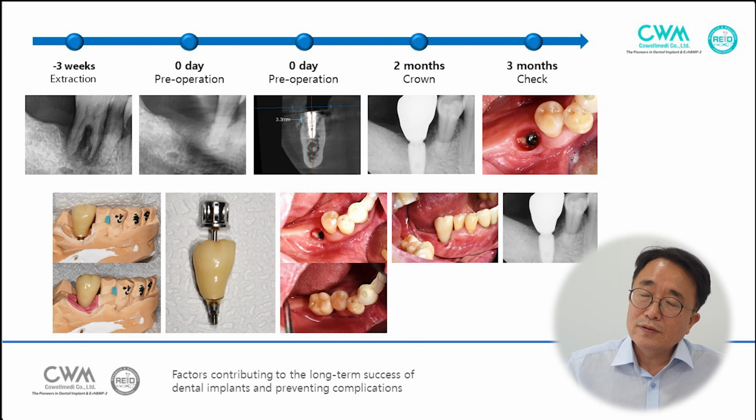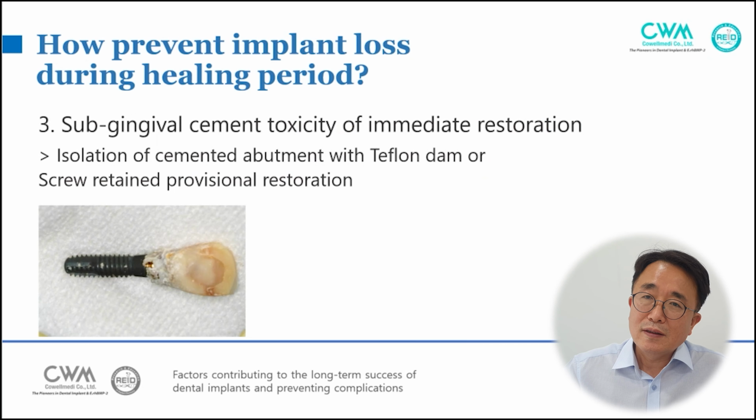So we have to keep this flap closed during the healing period, even if you use titanium mesh or a healing abutment. So I recommend the tension-free flap operation. Subgingival cement toxicity of immediate restoration has to be prevented.